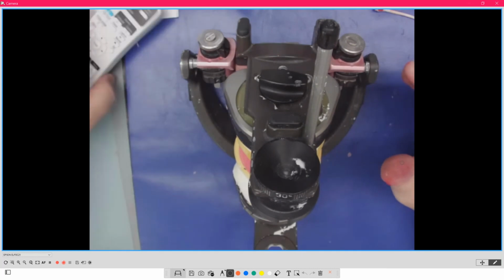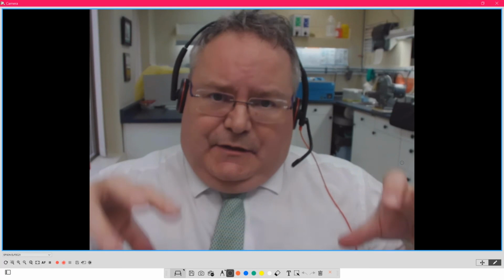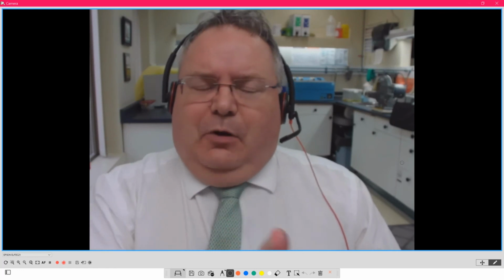So our takeaways here: number one, I want freedom and flexibility. So I use product that allows me to be flexible to the patient's needs. I've looked at a patient and identified, by looking at their jaw and watching them talk, their jaw posture. One thing you can do to train your eyes is, when you go home tonight, look at your loved ones at the dinner table and watch them eat. Or when you're watching the news, watch the newscaster or the reporters when they talk, and try to look at their posturing and see it.